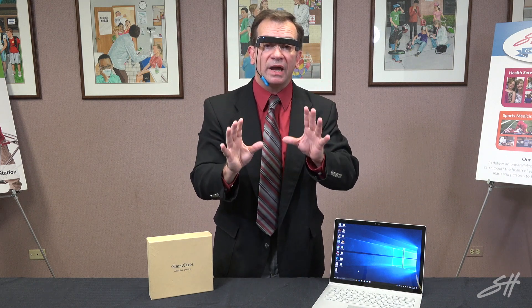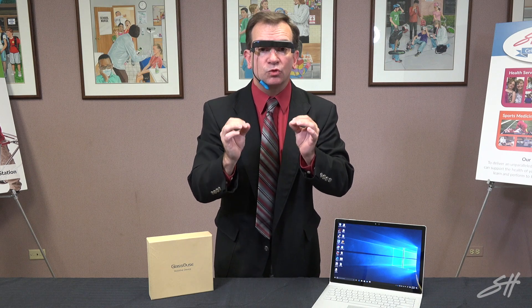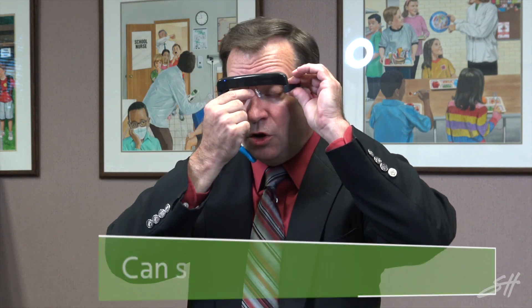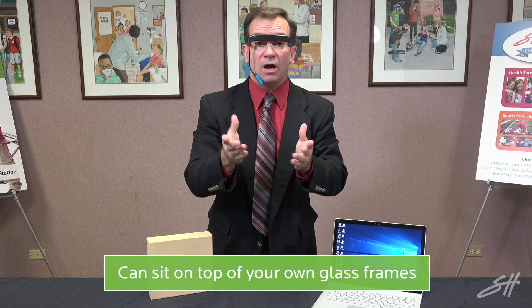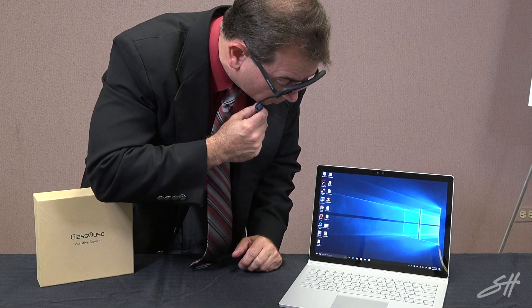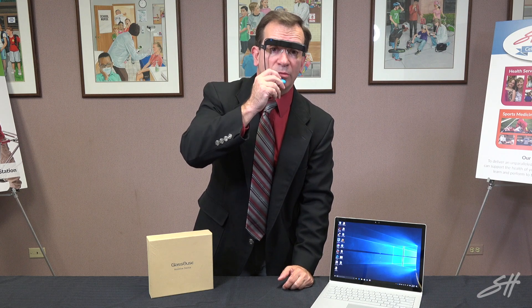Part of the strength of this is the fact that anyone can use it and there really isn't any type of training that needs to be included. If an individual needs to wear glasses, this nose piece can actually be taken off and this can fit right on top of the current frames of their glasses, still enabling that person to make the connection and be able to open anything that they might with a simple click through their mouth.